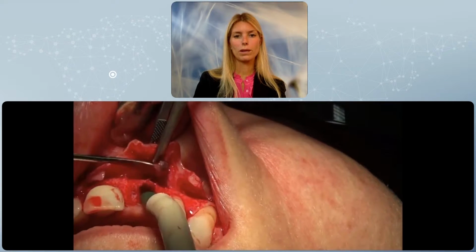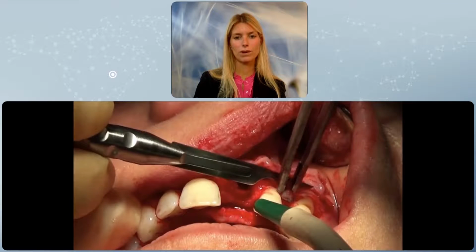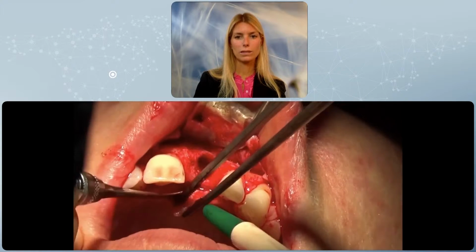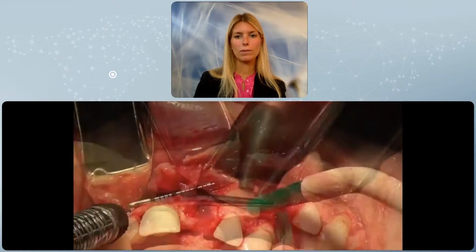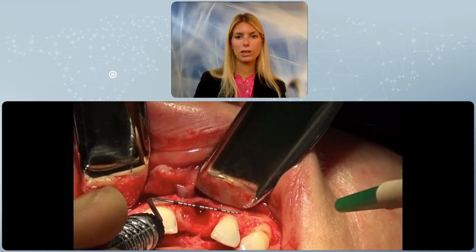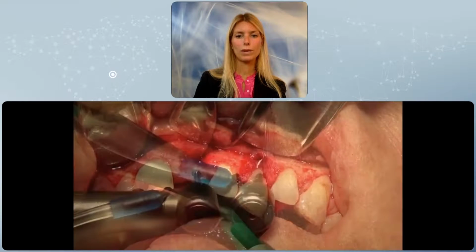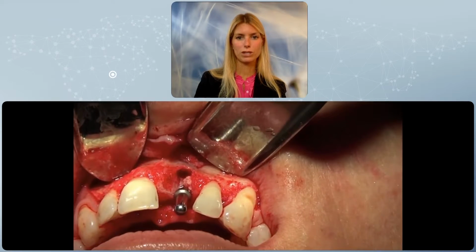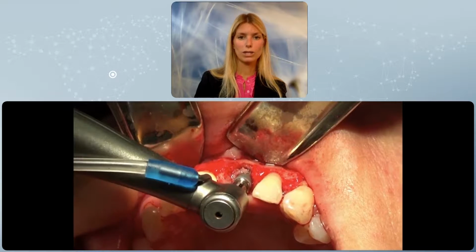We perform a full thickness flap elevation, we clean the sulcus very well, and now we have some proper bone that is waiting to have the implant positioned, which will be positioned in the right 3D position as I was mentioning before. And we realize naturally that there will be the dehiscence. It doesn't look from this vision very important, but it is certainly a dehiscence that requires a GBR.